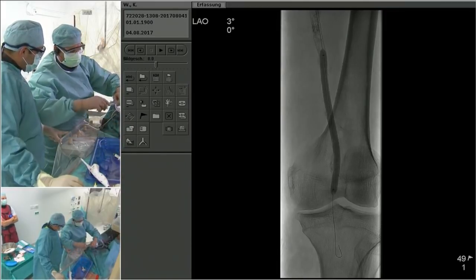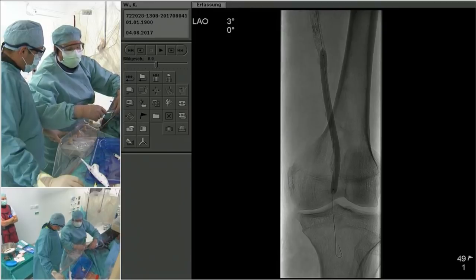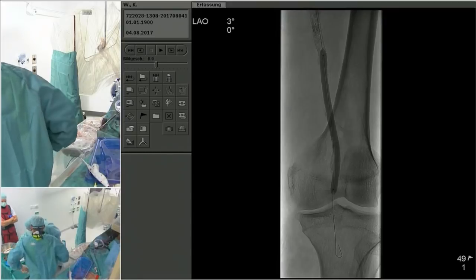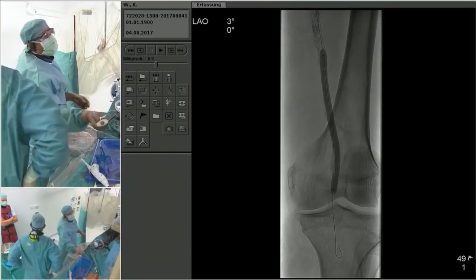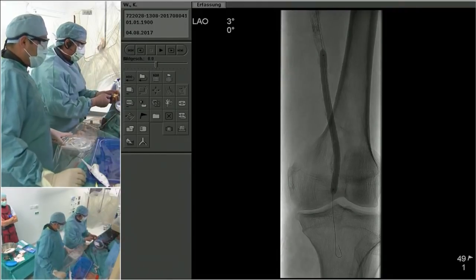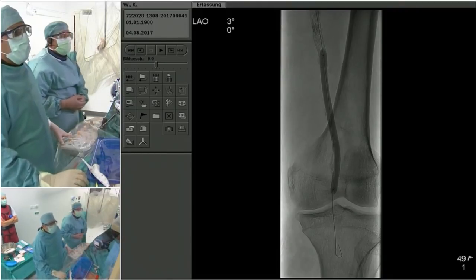Yeah, with this extent of calcification, I generally try using an angled support catheter and start with a straight, stiff glide wire. If that's not penetrating the cap, then I will generally switch to using, for example, an Astato 30 wire to penetrate the cap with a stiff 018 CTO wire.